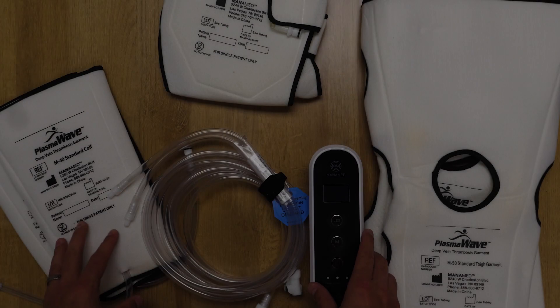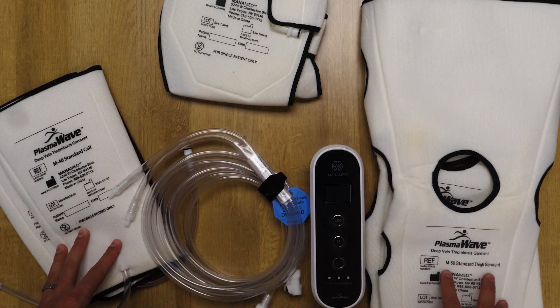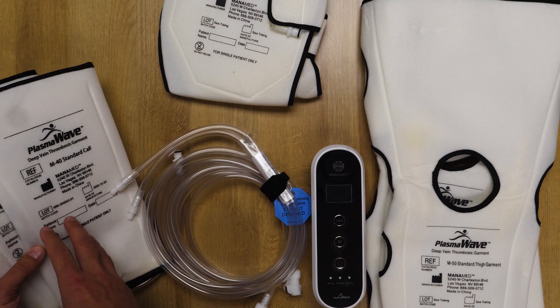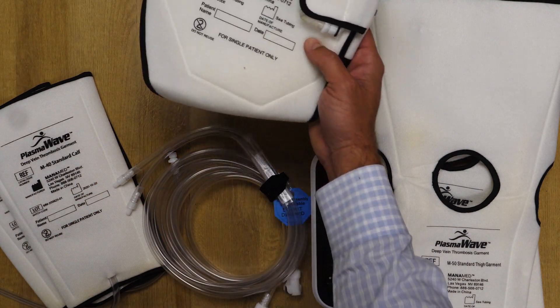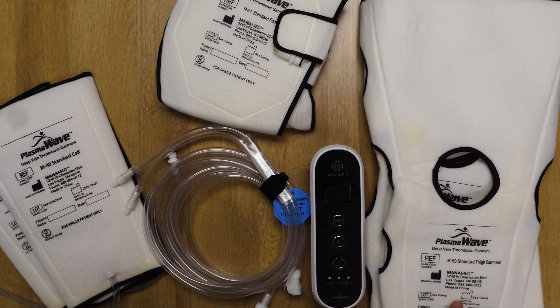The PlasmaWave for ManaMed also comes in a disposable version for the sleeves. We have a set of standard size calf sleeves, a set of extra large calf sleeves, a pair of foot sleeves, and a pair of full leg thigh sleeves.